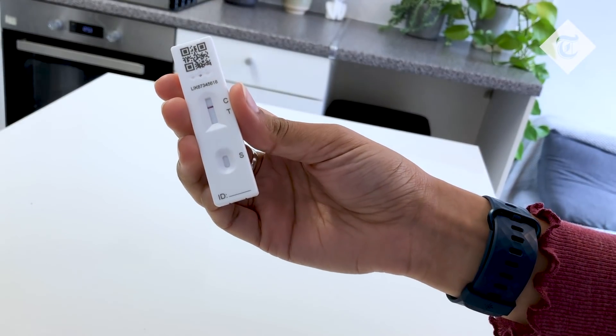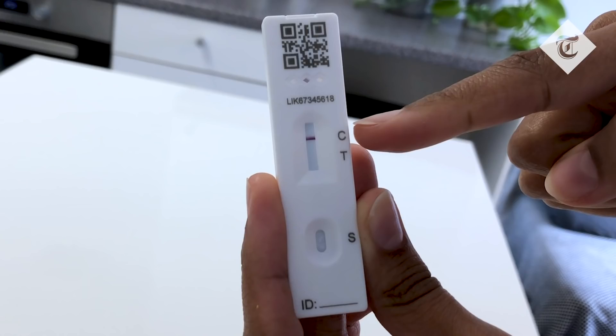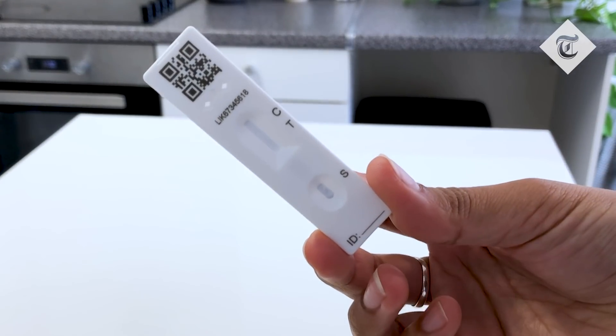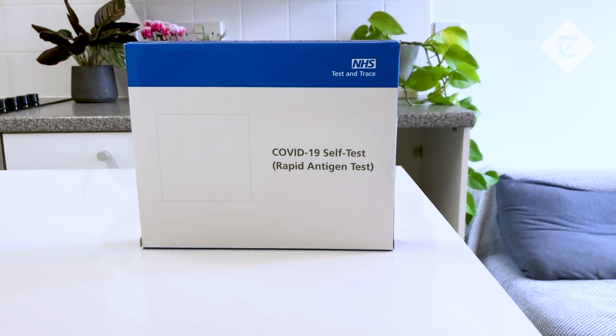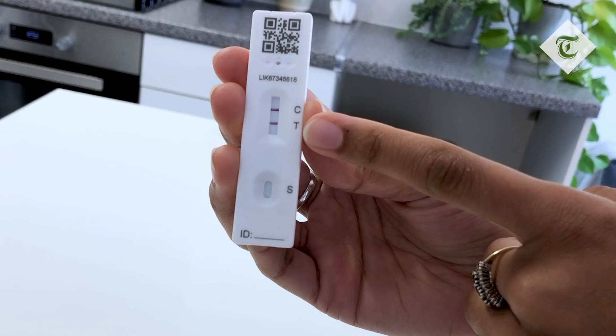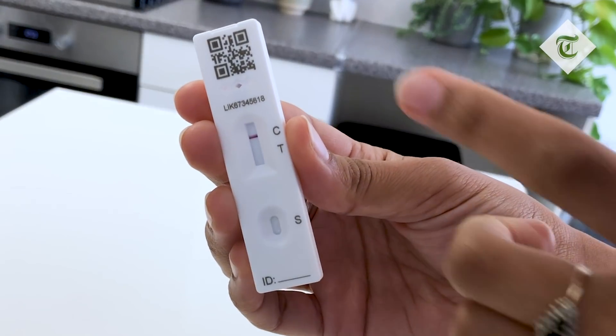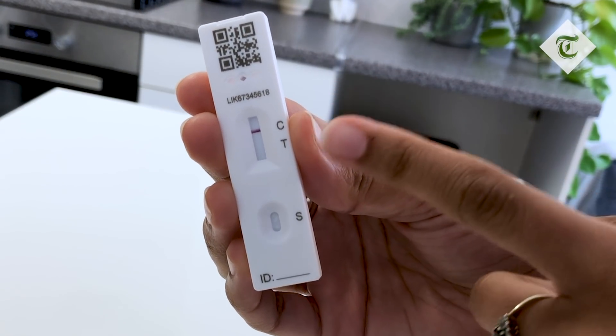The result. After the full 30 minutes, check the results. C indicates whether or not the test is valid. If there's no line by C, your test is invalid and you need to take another one. T indicates whether the test is positive or negative. If there's a line, even faint, this is a positive result. If there's no line next to T, it means you have a negative result like this one.